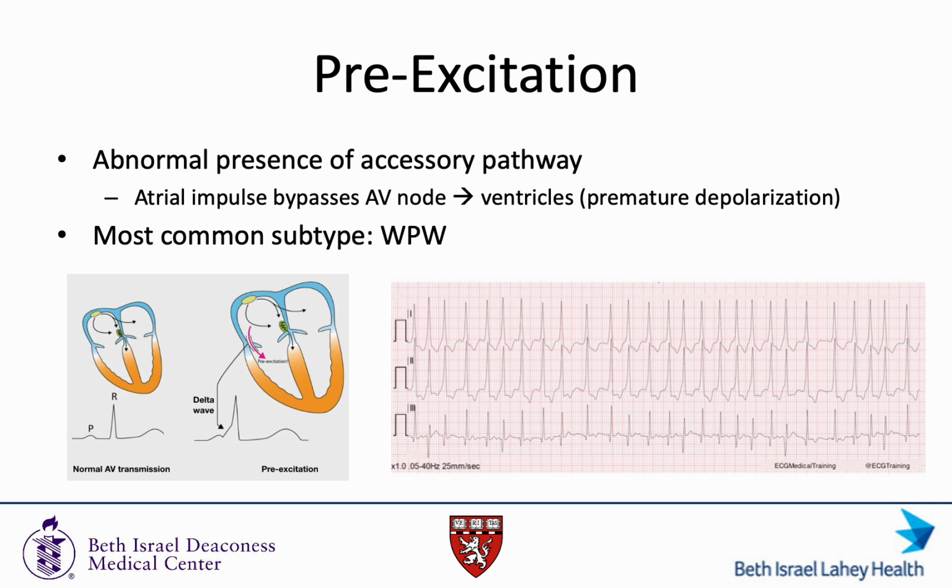We can see this delta wave clearly in this EKG, most notably in lead 2, circled here, but also visible in lead 1 with slurring of the upstroke. This EKG is one of a young man with atrial fibrillation and Wolff-Parkinson-White. Note the wide complex rhythm with pronounced irregularity and absent P waves. So this is what we call pre-excited atrial fibrillation.